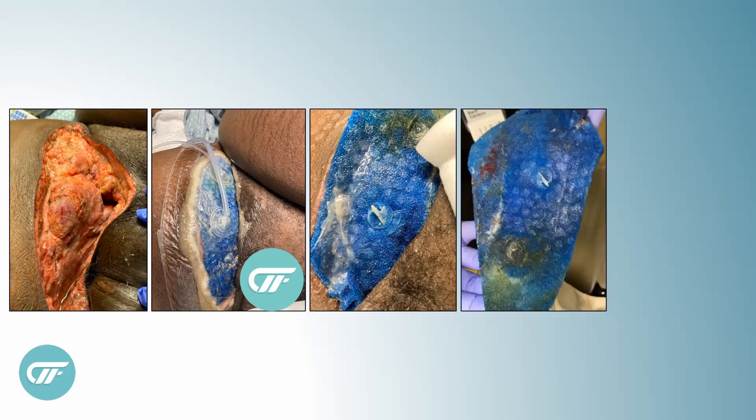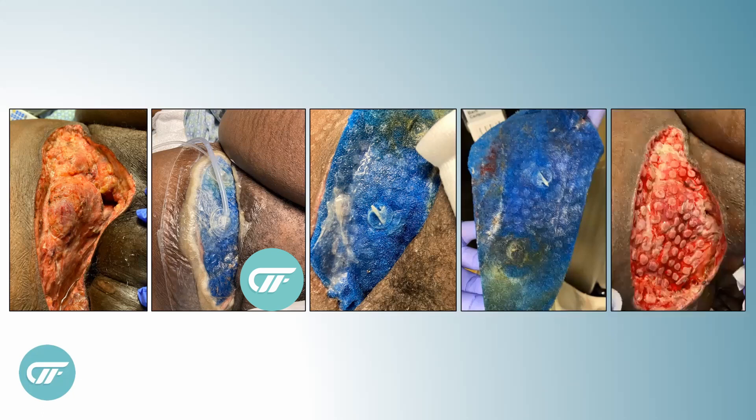Here's what the top of the wound dressing looked like after I peeled the drape, and this is what the patient's wound looked like in just one dressing change, which is really quite remarkable how much work this dressing actually can do.